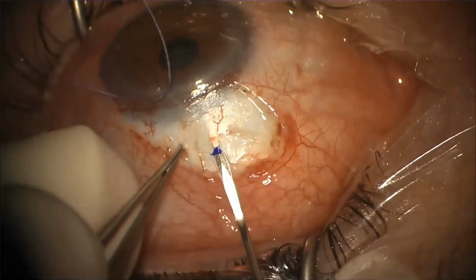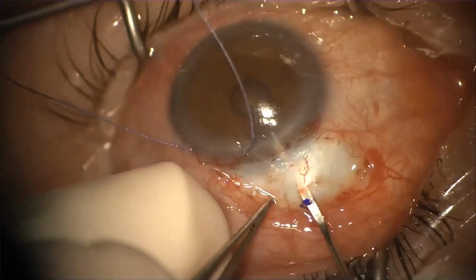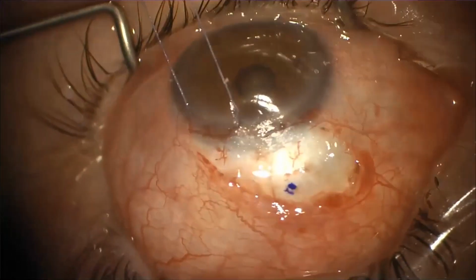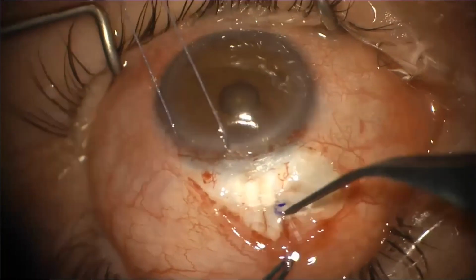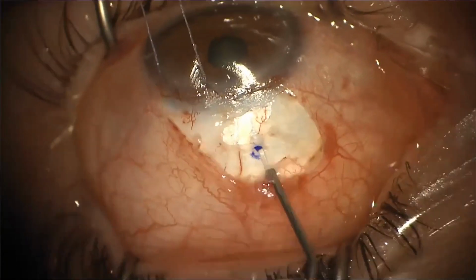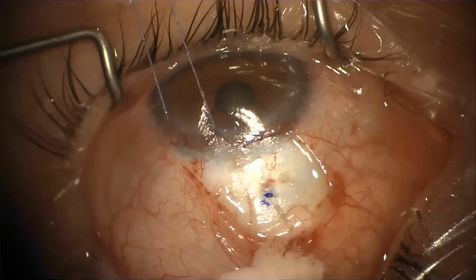Here's what I'm saying. You want to kind of stay deep and then lift a little bit right when you get to the blue-gray and angle a little more posteriorly. We're going to take then the microshunt and slide it right into the track, and the fin should sit perfectly into that little opening there in the sclera. Here's where we're priming the device with the BSS on a cannula. And again, percolation of flow.